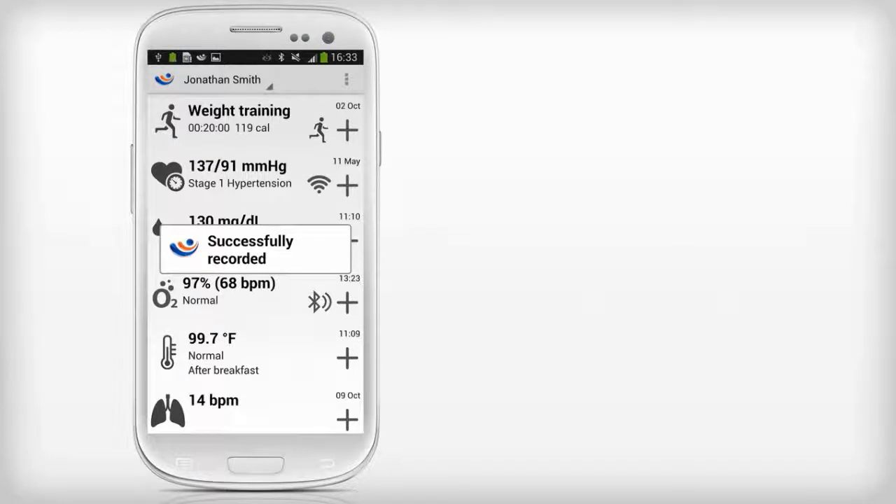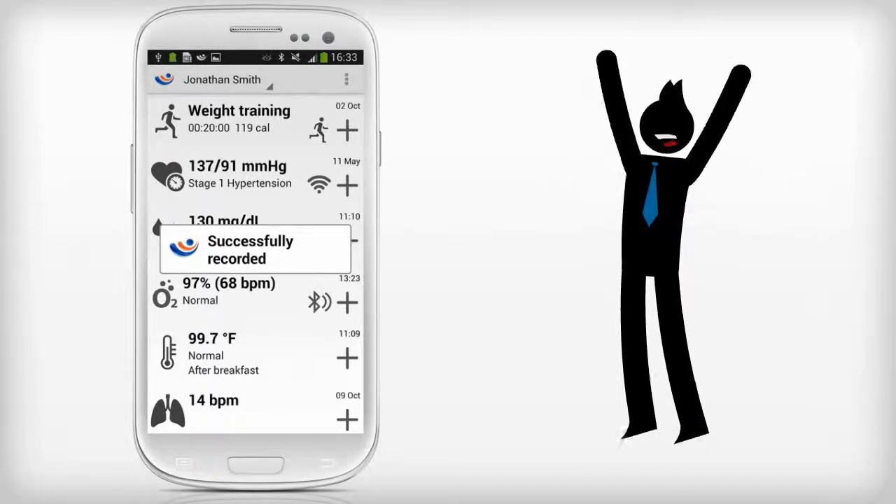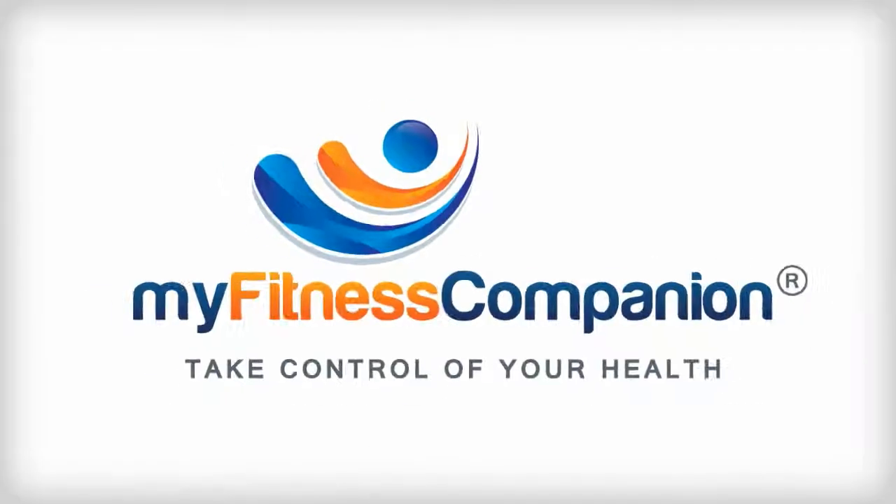MyFitness Companion will automatically receive the blood pressure reading from the Fora monitor. You have successfully paired the Fora D15 monitor with MyFitness Companion.